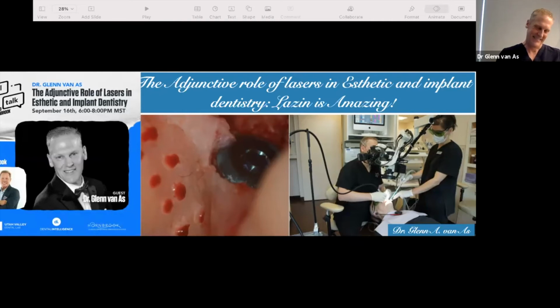One thing that you didn't really address, and there's been some good questions, but I think I answered them. So, you know, the whole 980, 810 thing. For those who don't have diodes, different manufacturers will either say they have an 810 nanometer or a 980. And if they sell a 980, they're going to say 980 is better. If they sell an 810, they're going to say the 810. I have both. I notice no difference at all in hemostasis, postoperative pain. What's your thoughts on that? Yeah, I agree. You know, I'm fond of saying a diode is a diode is a diode, and they all work well.